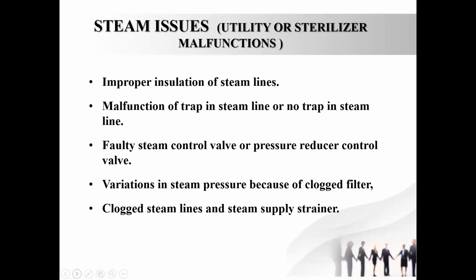Steam issues can be due to your own hospital utility, or due to the sterilizer malfunction, either of the two. It all depends. If you have the boiler which comes with the autoclave, then the sterilizer manufacturer will be responsible. If you are having steam from a central source in your hospital, then your maintenance department or utility will be responsible. In both cases, there can be improper insulation of the steam lines.